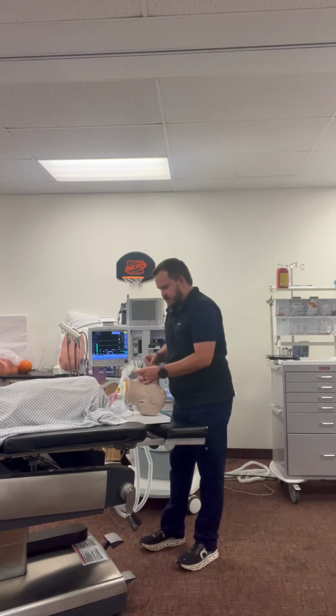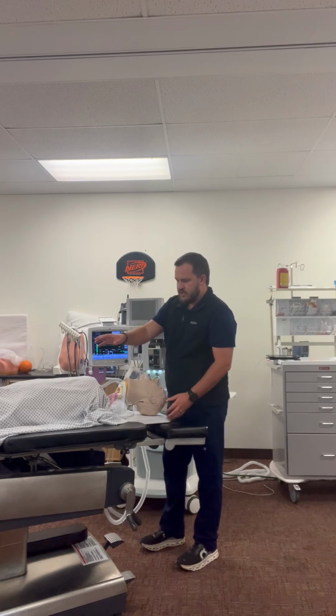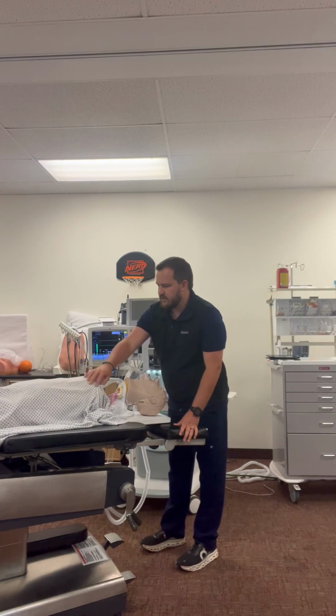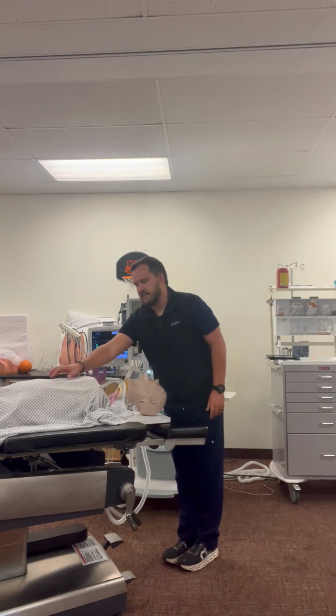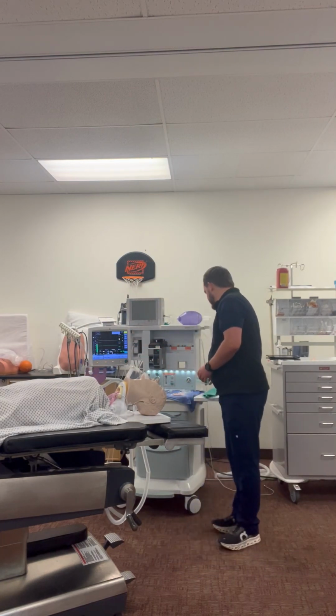I should see fogging of the tube. Make sure it's secured. Equal chest rise, no rising of the stomach. I will listen to the chest, make sure that's confirmed, and listen to the stomach. And then I should see an increase in end-tidal CO2, which means it's placed appropriately.